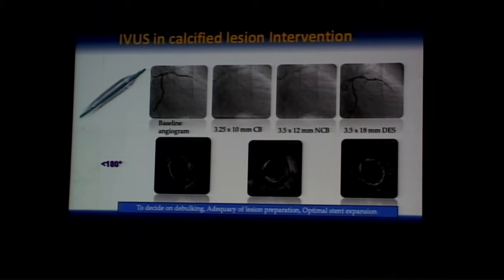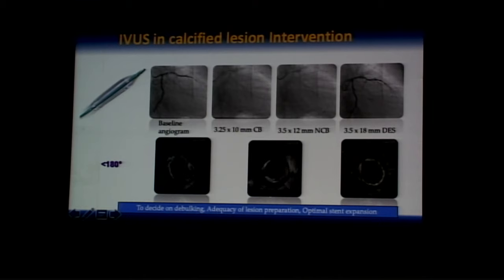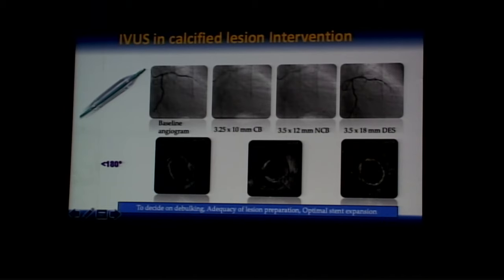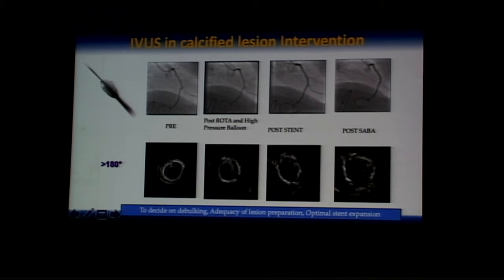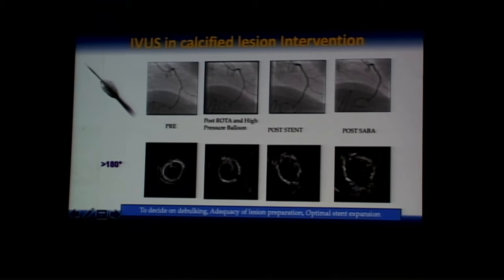For calcified lesion interventions, IVUS helps in three areas. First, selecting a debulking strategy based on calcium arc: less than 180 degrees calls for a balloon-based strategy; more than 180 degrees requires an atherectomy strategy. Once the strategy is decided, IVUS confirms calcium fracture or dissection, predicting good stent expansion. For example, a 360-degree calcium lesion resistant to balloon dilatation — after atherectomy, balloon dilatation induced a fracture, allowing full stent expansion. IVUS then helps optimize the final stent result.